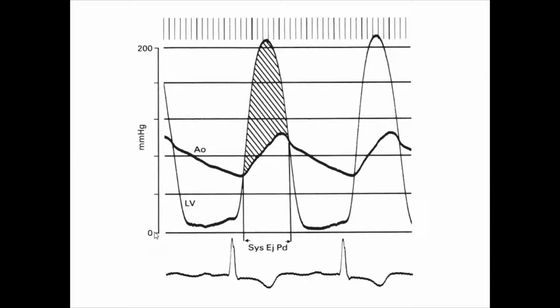If you are asked about diagnosis, it is okay, you can read all of it and then put the diagnosis. But now we are using this example as a typical description for hemodynamic waves. So simultaneous hemodynamic tracing between LV and aorta in a scale of 0 to 200 with ECG tracing in normal sinus rhythm. Then come to the LV and aorta, and what is the finding?